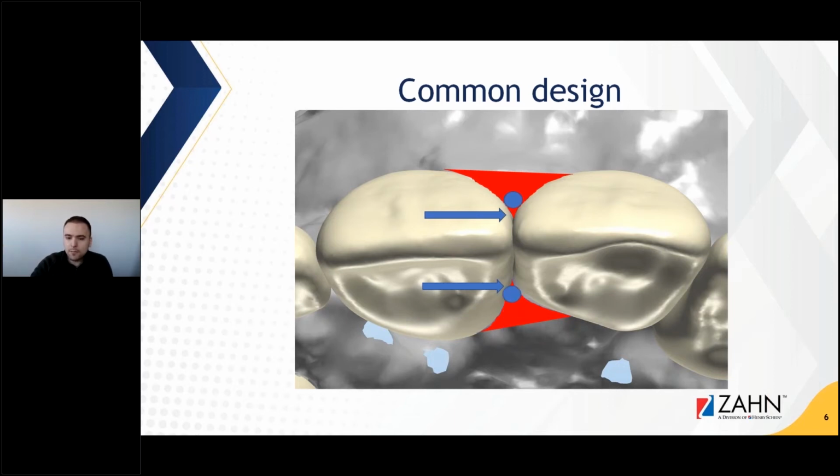It's going to do the same thing on the lingual as well. It's just not going to be able to reach that area. Also, where you see the blue arrows, they accentuate that small triangle, that unreachable area. Now, when you do your CAM strategy calculation, the software is going to try to calculate to reach that area. By exposing that area and making it available for calculation, you're actually increasing your calculation time, which becomes more noticeable when you have a large bridge. If you multiply that by 14 teeth, and all the interproximal connections, buccal and lingual, and put it together, you actually add calculation time.